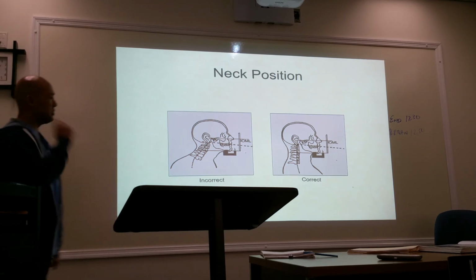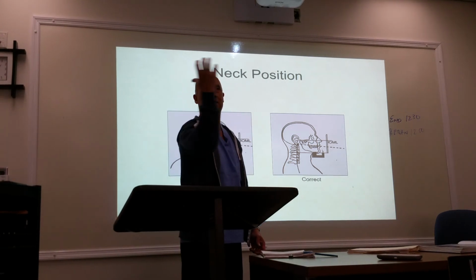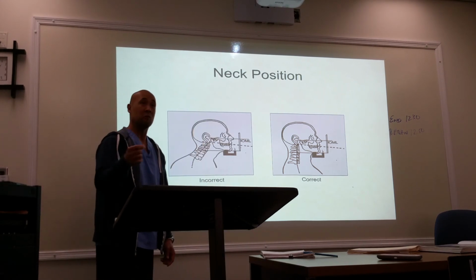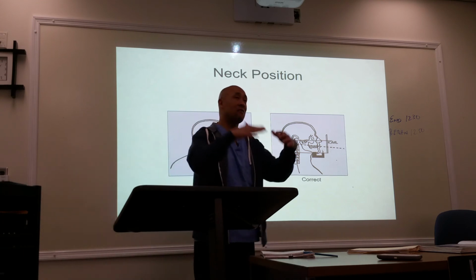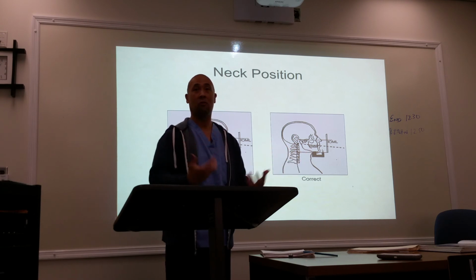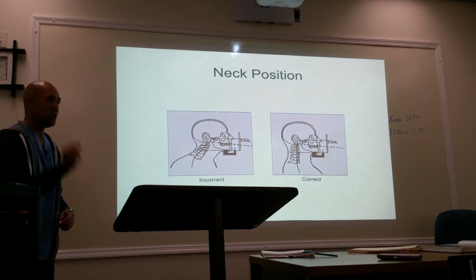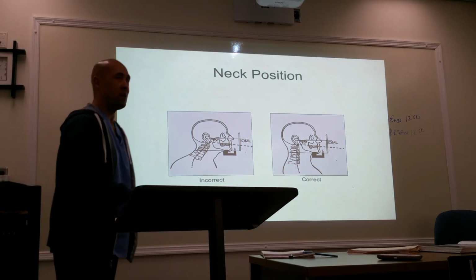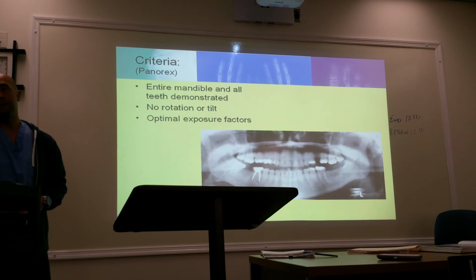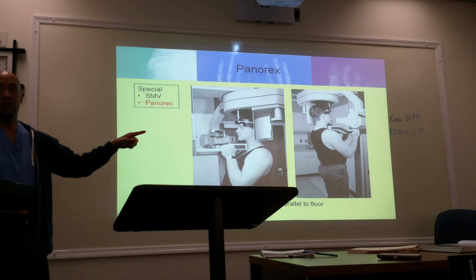And it's one of those exposures, again, the exposure itself takes anywhere between 3 to 4 seconds, so it's just zzz all the way around. Is that a lot of exposure? Okay, remember your reciprocity law? The length of the exposure might be long, but mA is going to drop to maintain your total overall mAs, total exposure. So maybe 3 or 4 seconds, but if I adjust my mA accordingly, then they should not be getting an overabundance of extra exposure. All right, are we good here? You want to start all over again? No. We got it?